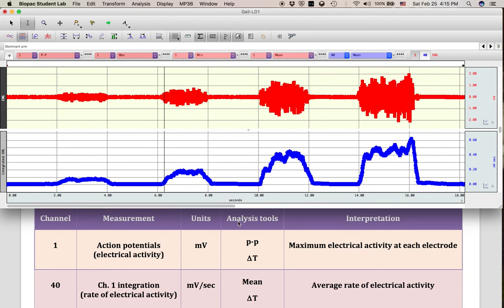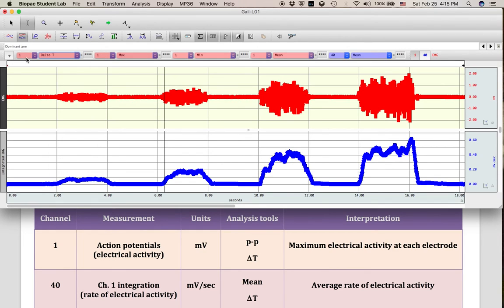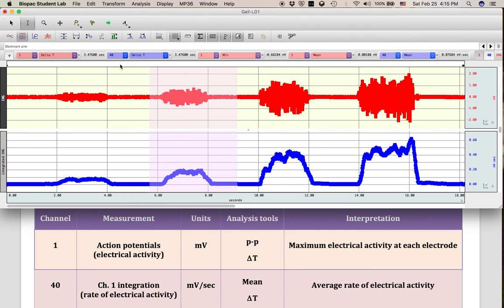We can also measure change in time using the delta T. If I choose channel 1 delta T and channel 40 delta T, I'd like to show you that those two values will always be the same because they're sharing this x-axis. What they differ on is their y-axis values, whether we have positive and negative or only positive values.